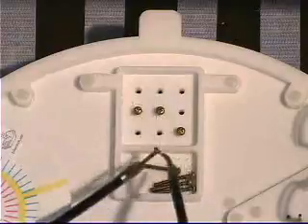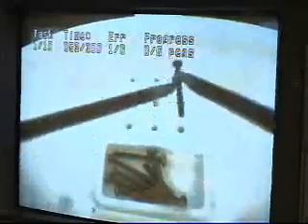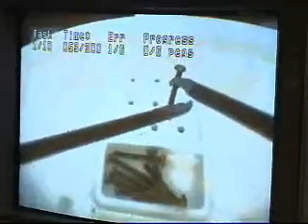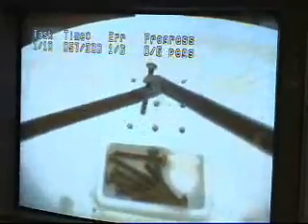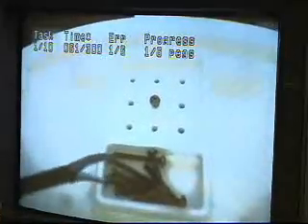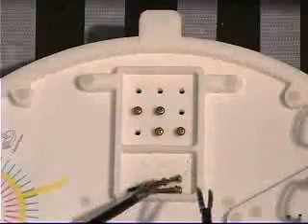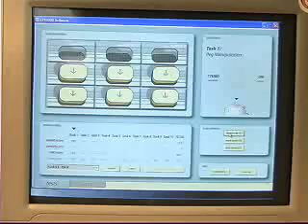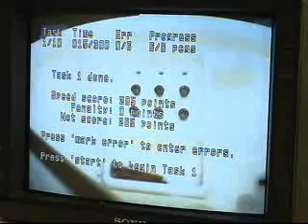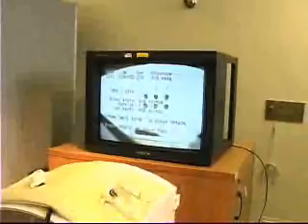The system senses each peg as it is placed. The task starts when the first peg is picked up and ends when 6 are entered. Ten penalty points are assigned for each peg dropped, up to a maximum of 60 points. A summary screen will be shown after each task and includes the final score, the penalties, and the time taken.